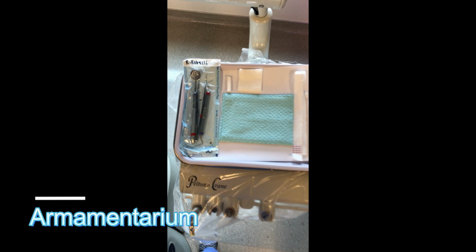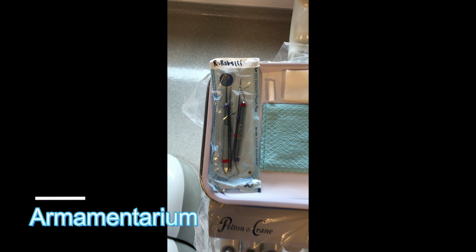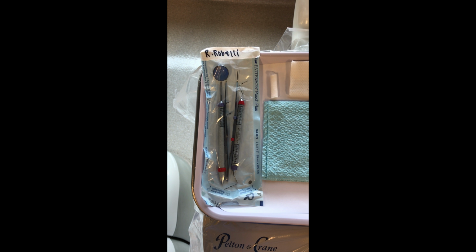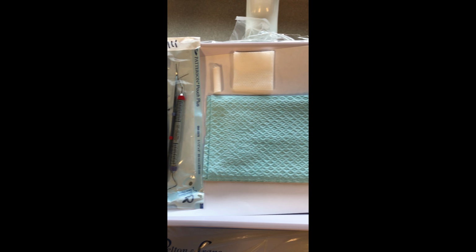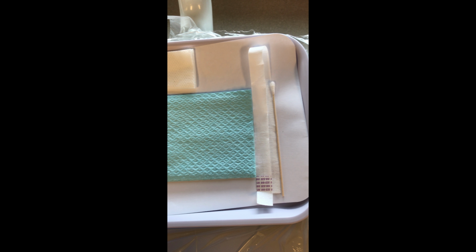Prior to starting the intraoral examination, you need to have the necessary armamentarium, which includes PPE, a mouth mirror, a probe, 2x2 gauze, a cotton roll with petroleum, a cotton swab, and a patient bib.